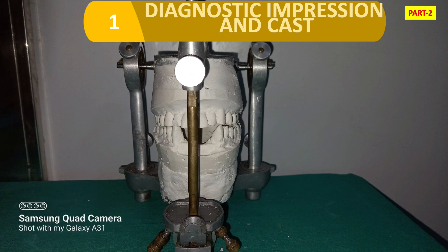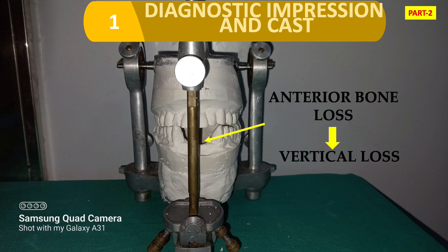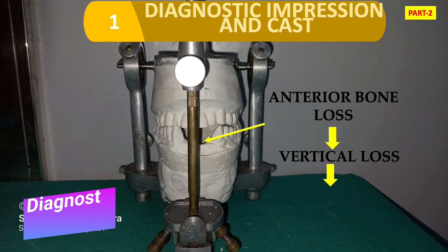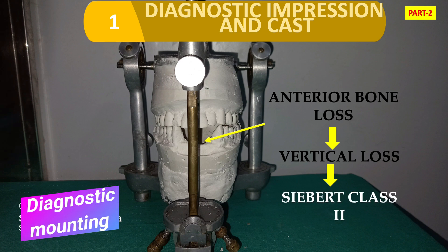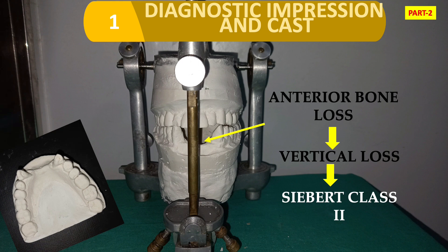In this diagnostic mounting, we have an anterior bone loss — it means we have a vertical loss in height. So this falls in Seibert Class 2. As I already told you, there is a loss in height but the width is maintained. This is a classic example of Seibert Class 2.